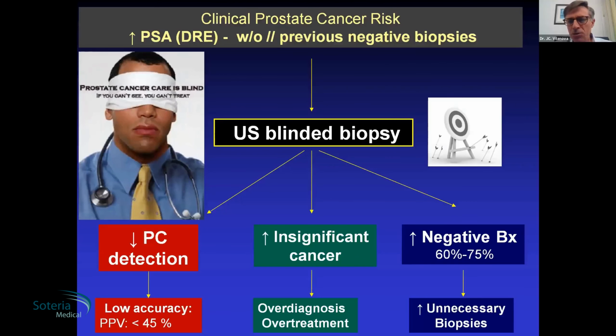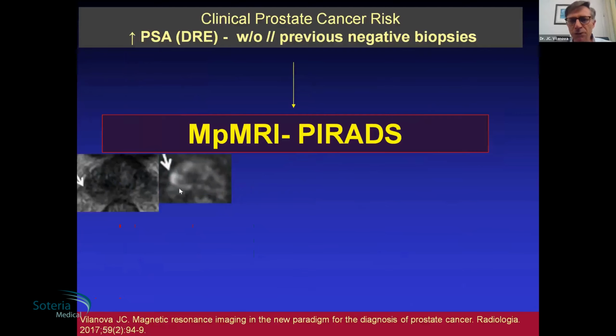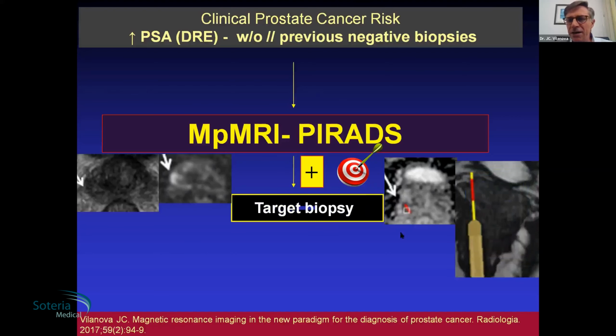And this is obvious. That we have MRI. MRI is going to see something, not in every sequence. This is why we have to apply the power of the diffusion sequence, where I see this high signal 7 millimeter lesion. Then it's time to plan to place a needle here using diffusion, and at the same time I plan with the ADC. I know this is the lesion that I should move my guide to and finally place, and I know that the sample is going to be from this exact lesion that I have planned.